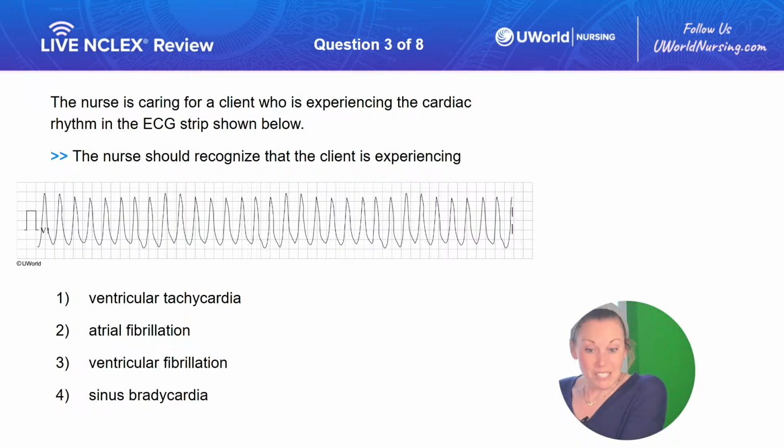All right, I'm seeing a bunch of option 1s come through. Well done, you guys. Good work, good work. That was quick. I'm glad y'all can quickly identify that strip. Good job, you guys. Well done.